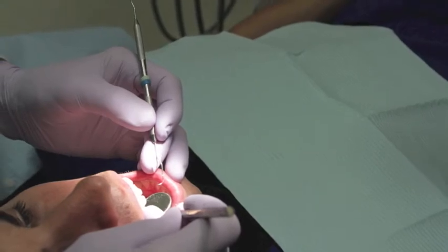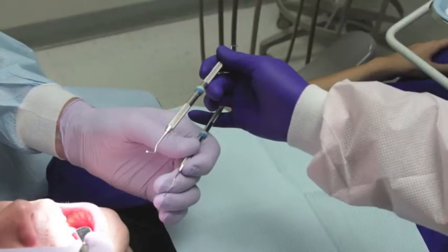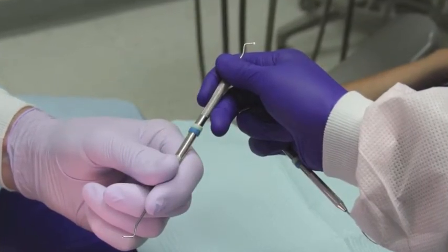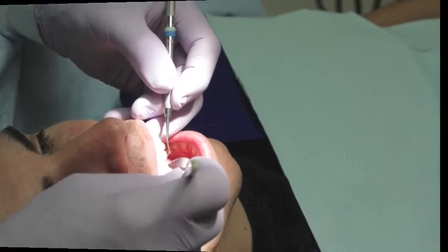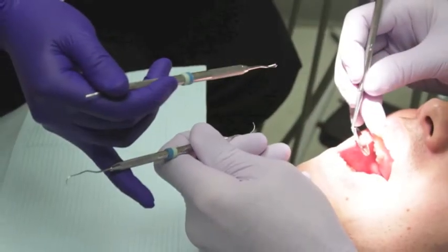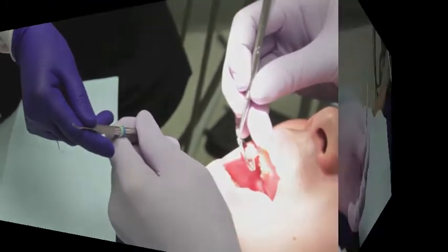In these images, notice how the doctor's hand, which is in lavender, and the assistant's hand, which is in purple, effectively transfer the instrument. Notice how the assistant will extend her little finger, grasp the doctor's instrument from underneath, and then deposit the instrument that they are holding by their thumb and forefinger into the hand of the doctor. There's a variety of angles here, so notice how the instruments are transferred.